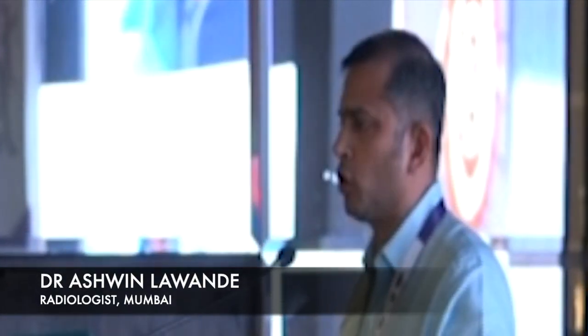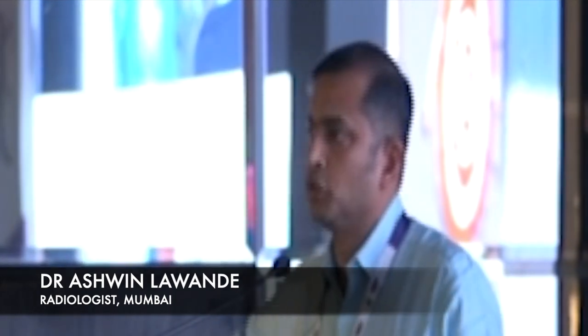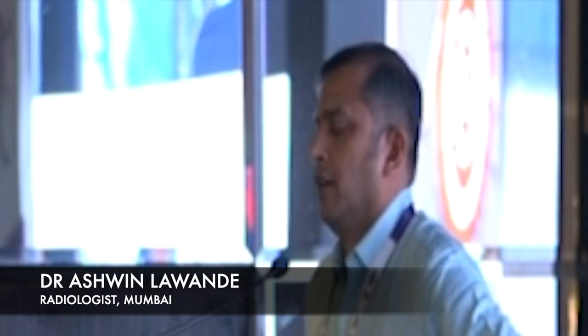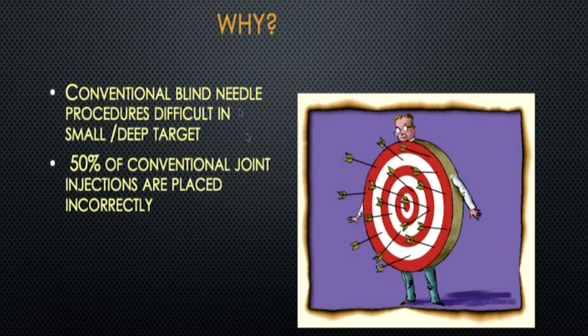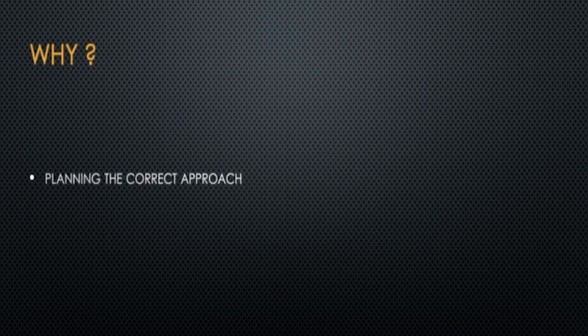Whenever orthopedic surgeons used to do blind procedures earlier, they always thought they were in the right place, but literature says that's not correct. Almost 50% of conventional joint injections are placed incorrectly. That's why we need ultrasound guidance — we are giving smaller doses at the precise location, and it gives good relief to the patient.